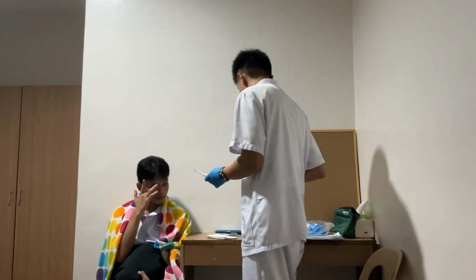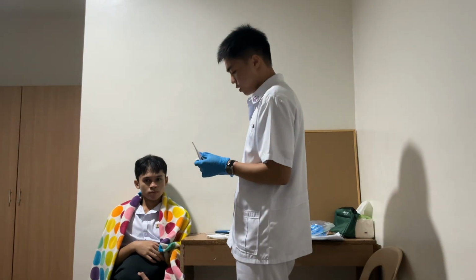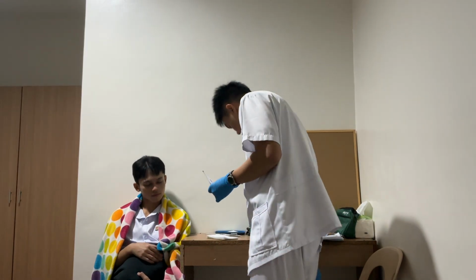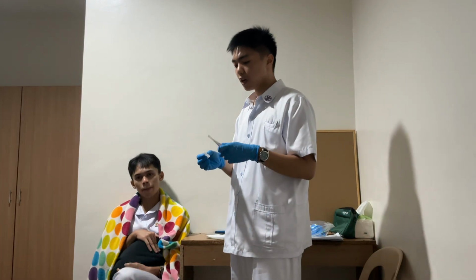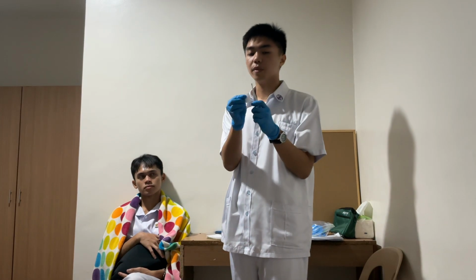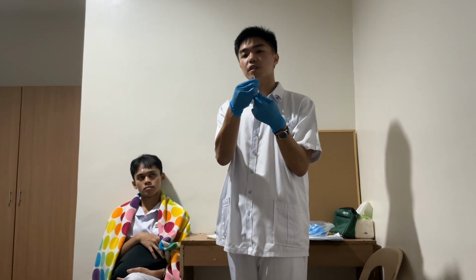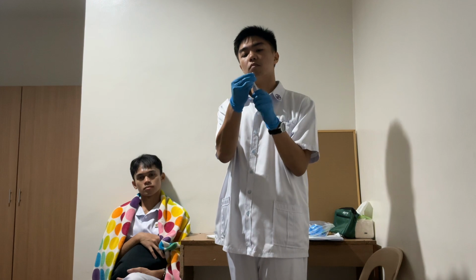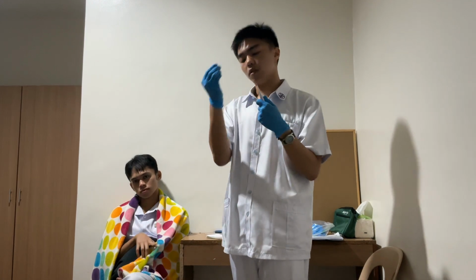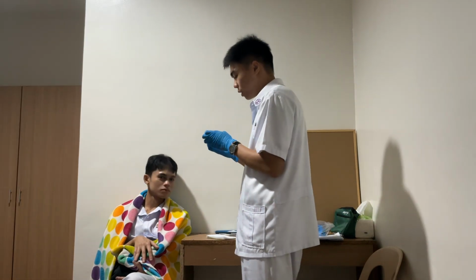So 36.7. So since we're done with that, we can now wipe the thermometer, ready to be used for the next patient. So this time, cleanest to dirtiest. Cleanest is the body, going to the tip of the thermometer, which is the dirtiest. So still, twist to firm, twisting motion. Okay. Discard, then store the thermometer.